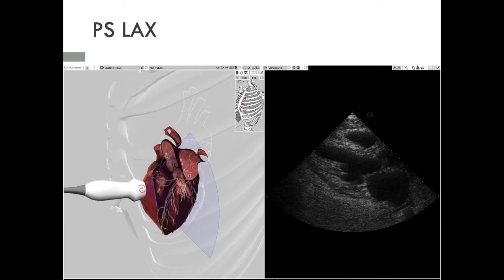Looking a little bit from the left side there, just to open up these structures, we can see that in our ultrasound image, the relationship between the sizes of the RV outflow tract and the LV outflow tract behind it, which is here, and the left atrium, roughly a third, and a third, pretty well equal in size.